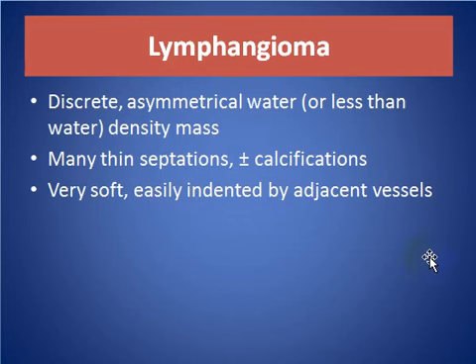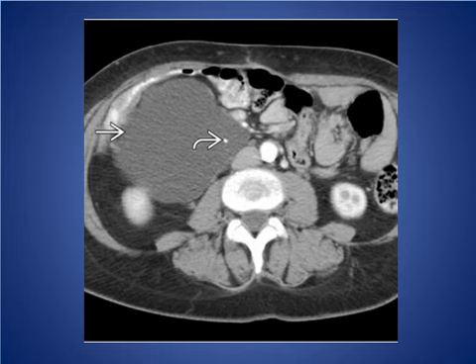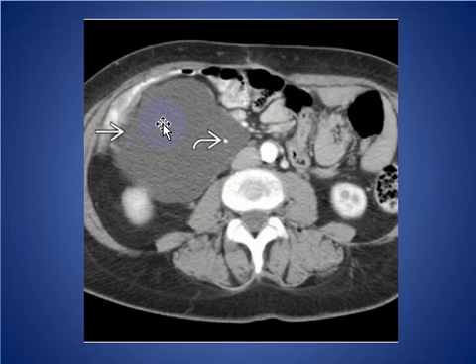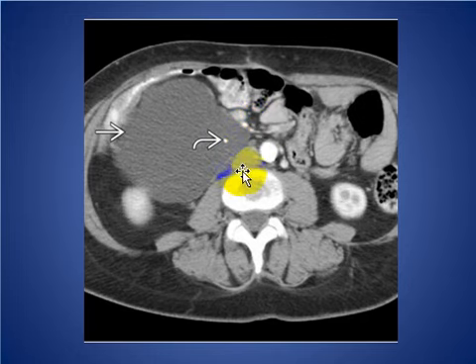Lymphangioma: a discrete, asymmetrical, water or less-than-water density mass lesion. Many thin septations are also noted, with or without calcification. It is very soft and easily indented by adjacent vessels. Here we see a large cystic water-density mass on axial enhanced CT displacing abdominal and retroperitoneal structures, with the presence of small calcifications suggesting lymphangioma.